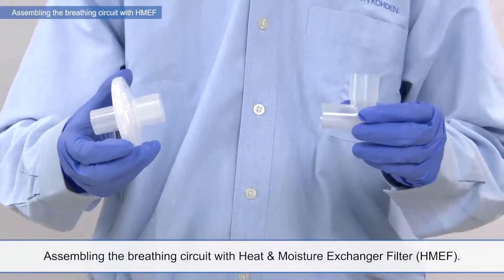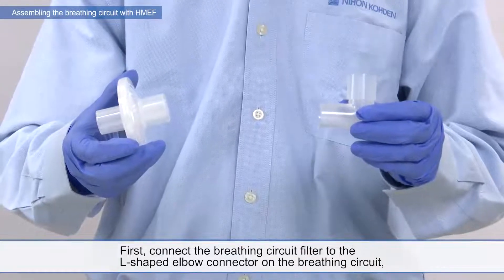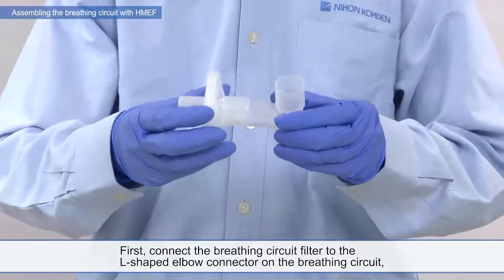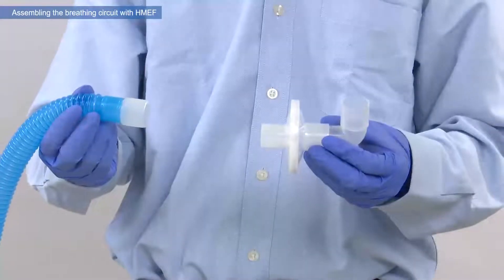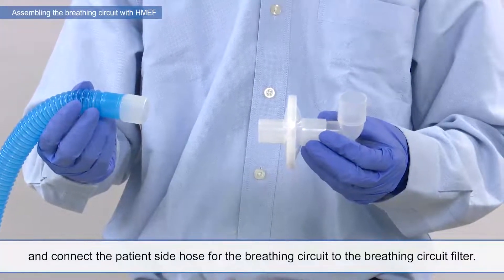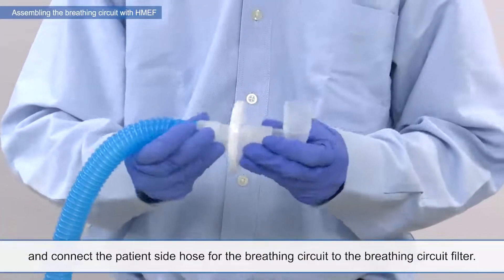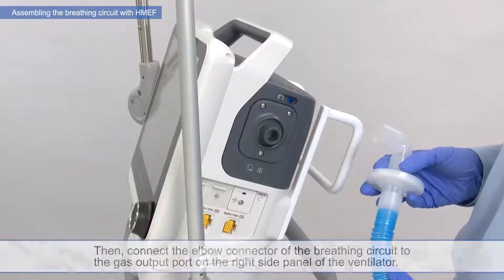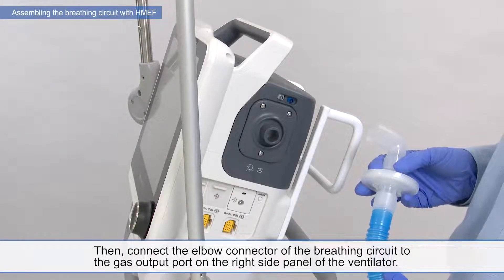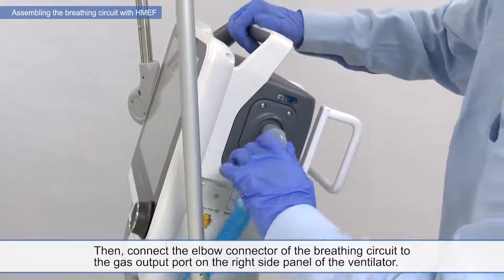Assembling the breathing circuit with heat and moisture exchanger filter. First, connect the breathing circuit filter to the L-shaped elbow connector on the breathing circuit. And connect the patient side hose for the breathing circuit to the breathing circuit filter. Then, connect the elbow connector to the gas output port on the right side panel of the ventilator.